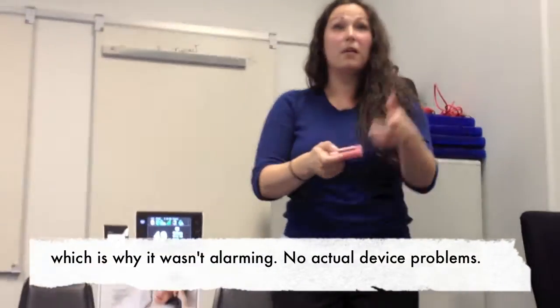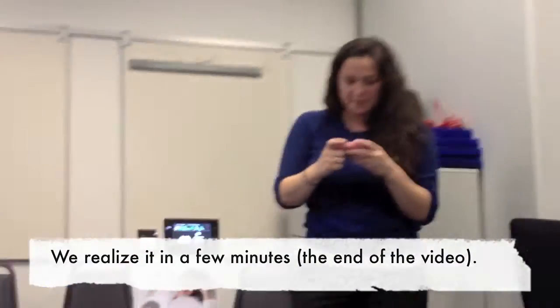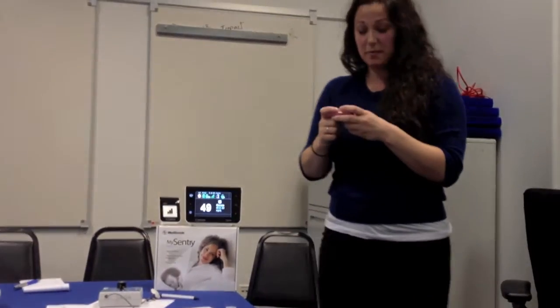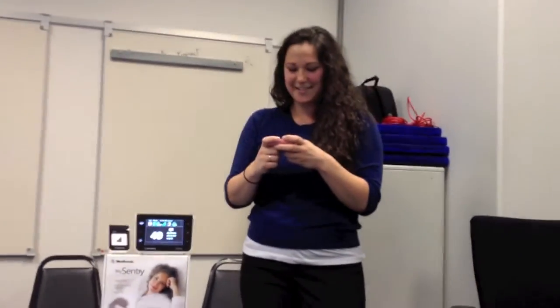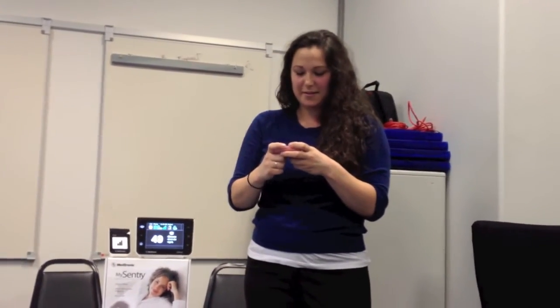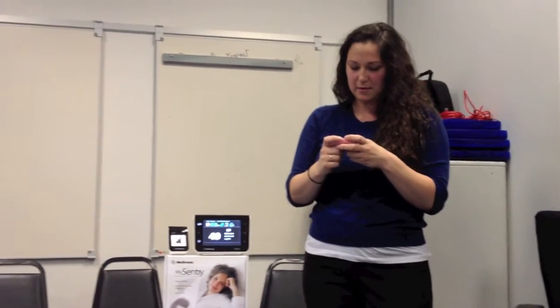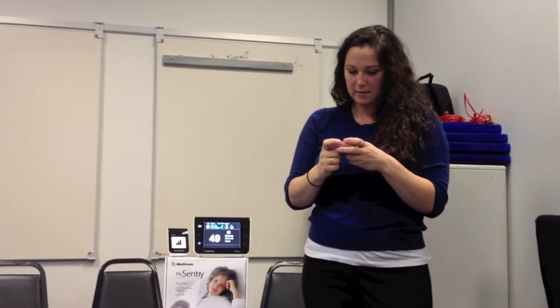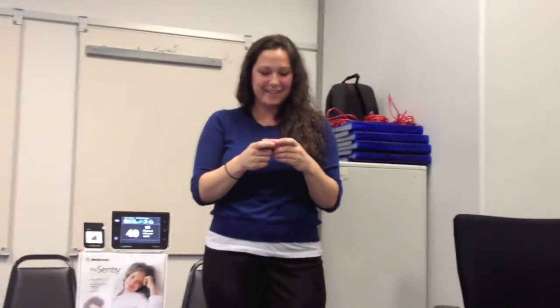Can I just comment? Absolutely. I like the fact that the font size for the reading is as large as it is. My alarm clock next to my bed is enormous because I cannot see, and the older I get, the worse it gets. Well, plus too, if an alarm goes off or something happens, and you have to look at your pump, then you have to find your glasses, or you have to put the light on. Now you're up. Yeah. So project it on the wall. That's a good idea. That's product development.